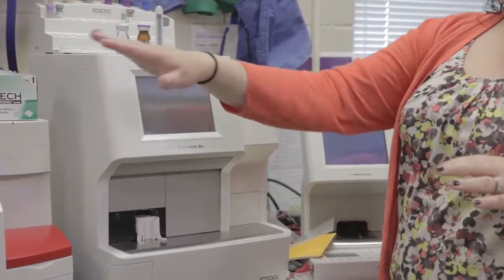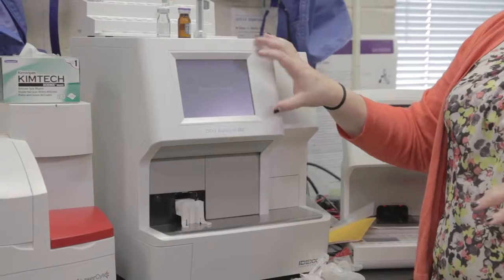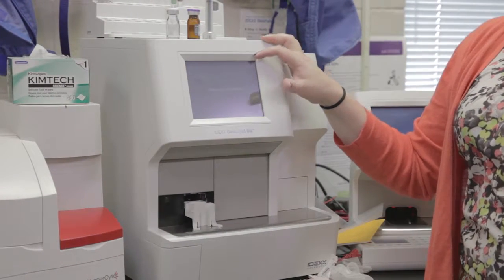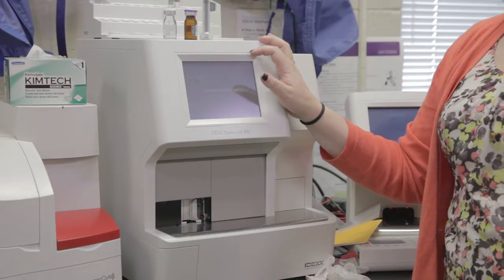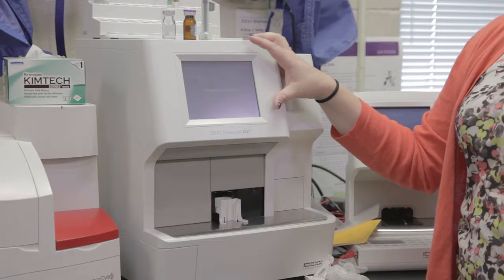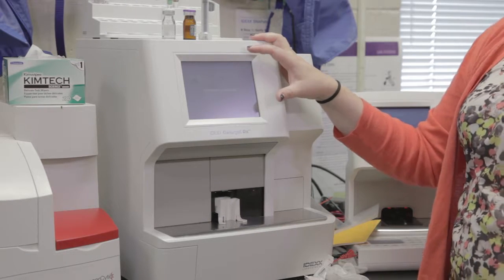The touch screens on each of these, you want to make sure if you're going to clean these that the analyzers are off when you do so. If you go to clean them with the analyzers on, you could end up confusing it because there's so much touch going on. And just use any normal touchscreen computer cleaner that you would use on your other computers.